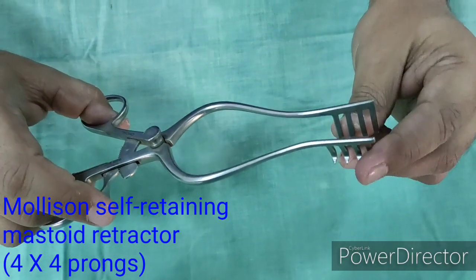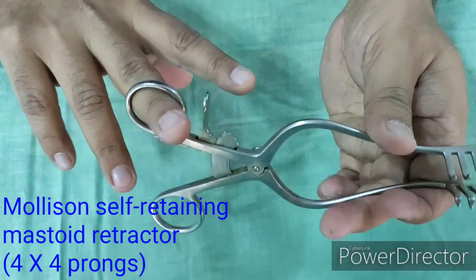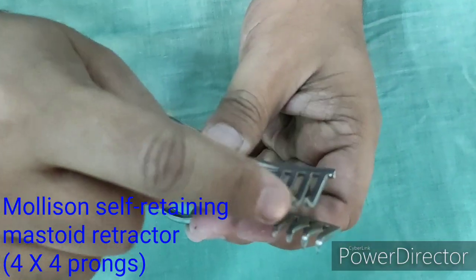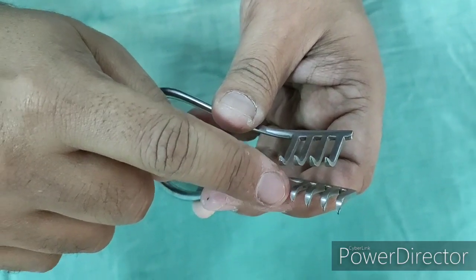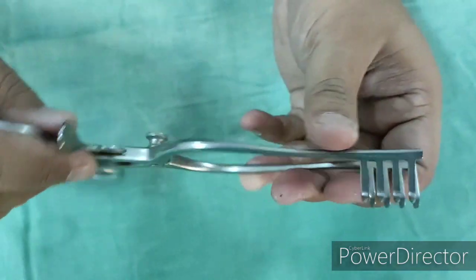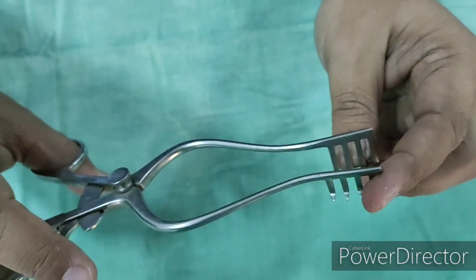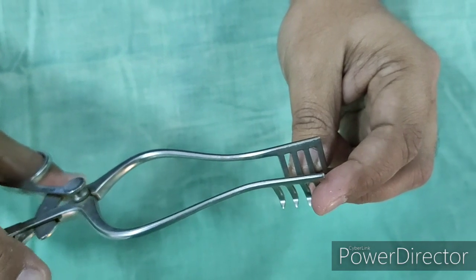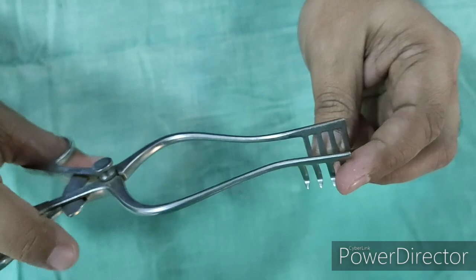This is Mollison's Self-Retaining Hemostatic Mastoid Retractor. It comes in different types. This particular instrument has 4×4 prongs, so it is called the 4×4 Mollison's self-retaining mastoid retractor. It is used in ear surgery to retract the postauricular tissues during tympanoplasty and mastoid surgery. It is also sometimes used in laryngofissure to retract soft tissue.